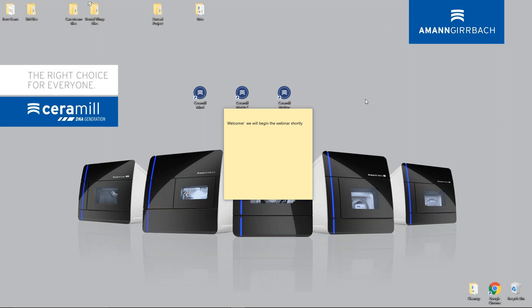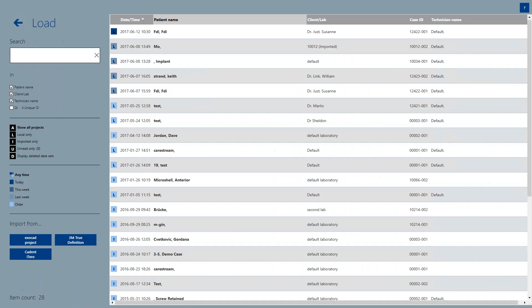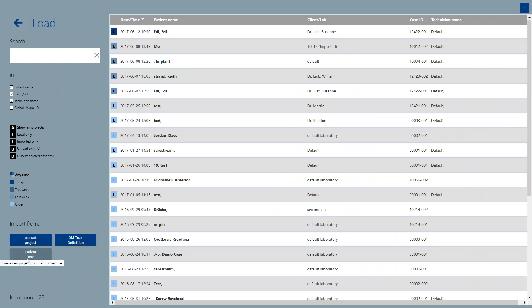We'll start off with some of the easier setups. We go into the Mind software. Normally we would load our cases right here, but with certain systems we can load a project. Down here in the bottom left corner you have ExoCAD project, 3M True Definition, and the iTero. These are direct project files.